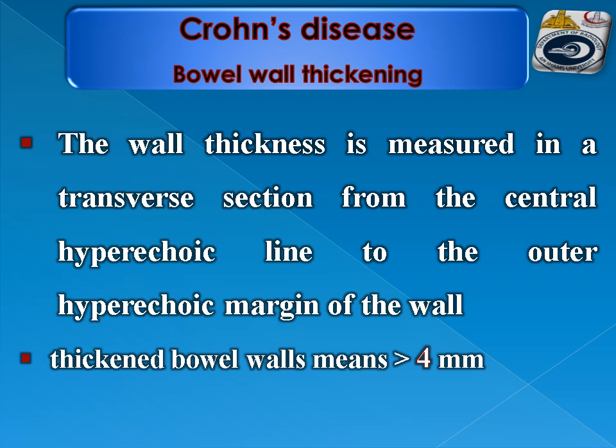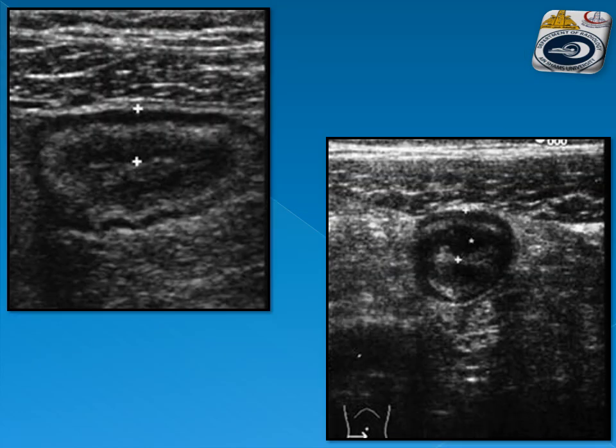Regarding bowel wall thickening: wall thickness is measured in a transverse section from the central hyperechoic line to the outer hyperechoic margin of the wall. Thickening of the bowel wall means more than 4 mm. It is more accurate to measure in transverse section. Examples show the measurements using calipers from the inner to outer hyperechoic line.